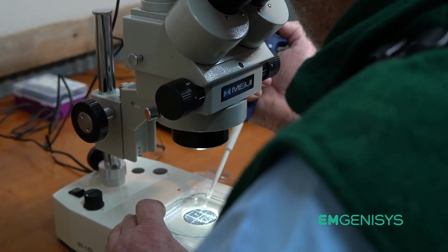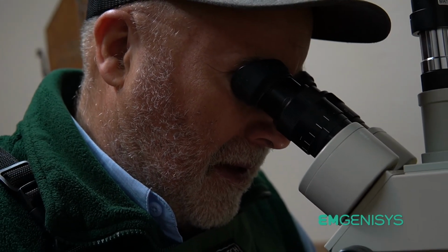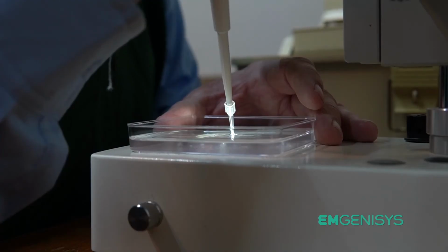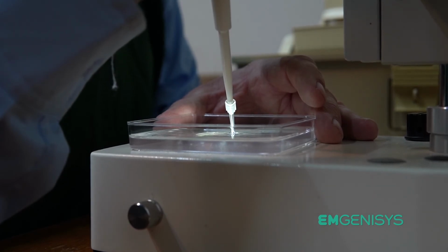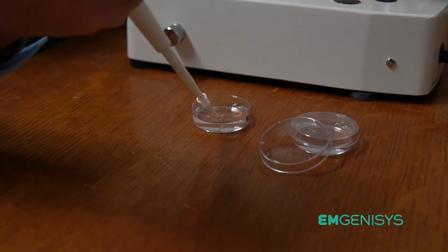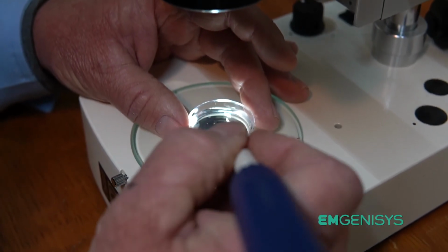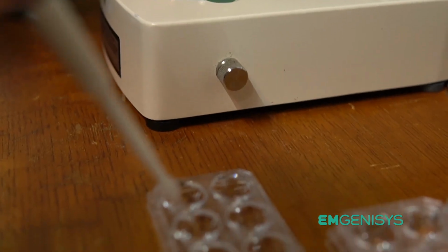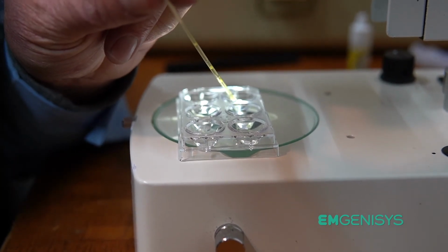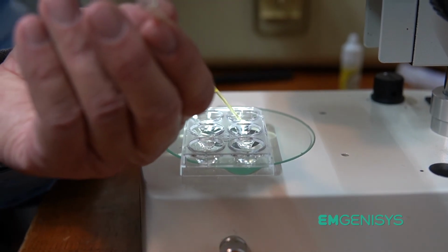We will not know if Dr. Killingsworth successfully collected any embryos until we get into the laboratory, because they are too small to be located with the human eye without a microscope. At this point, the donor cow is free to be released, and we will carry the embryo cup into the laboratory, empty the contents into the search dish, and search for embryos under a microscope. The veterinarian or embryologist will diligently search the dish looking for embryos. Oftentimes, there are traces of blood or mucus in the dish, which make it difficult to find the embryos. When an embryo is found, it is picked up from the dish with a pipette and moved into a new, smaller dish with clean holding media.